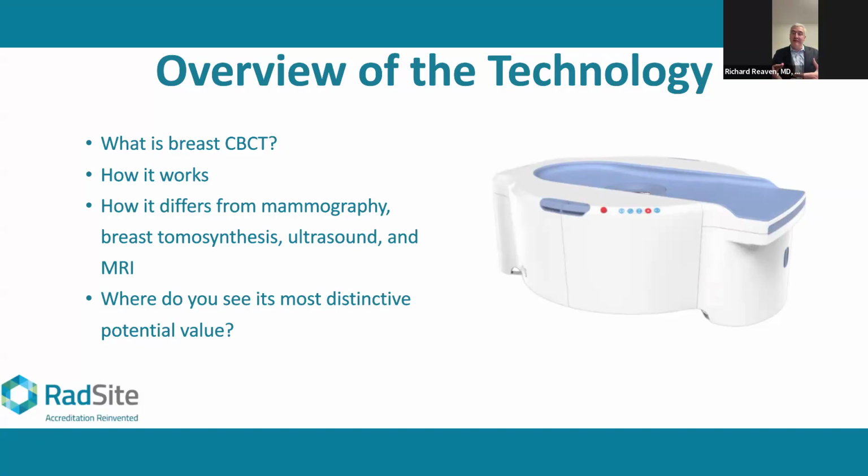If we're ever trying to find lung cancer, we're not going to be using a chest X-ray because it just doesn't have that sort of spatial resolution that we need to find those small cancers. And so for lung cancer evaluation, we're always going to use CT. Why? Because it's a truly three-dimensional examination, cross-sectional. We can pan through the images up and down, side to side, front to back, and we can really use triangulation as our friend to evaluate the abnormalities to see, is there any small growth in the lungs or not?